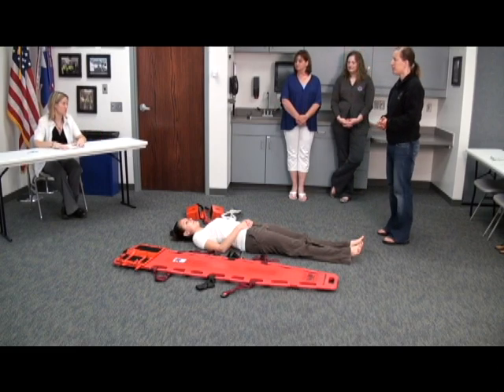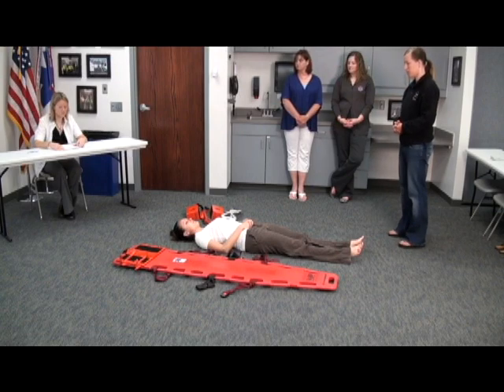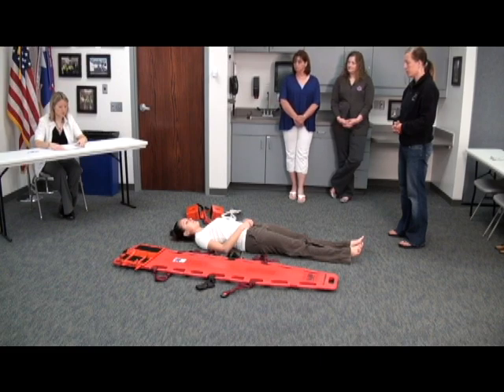You can examine your equipment as I read you the instructions for this station. This skill is designed to evaluate your ability to provide spinal immobilization to a supine patient using a long spine immobilization device. You arrive on scene with an EMT assistant. The assistant EMT has completed the scene survey as well as a primary assessment and no critical condition requiring any intervention was found. For the purposes of this evaluation, the simulated patient's vital signs remain stable. You are required to treat the specific, isolated problem of a suspected unstable spine using a long spine immobilization device. When moving the simulated patient to the device, you should use the help of both EMT assistants. One assistant EMT should control the head and cervical spine of the simulated patient, while you and the other assistant move the simulated patient to the immobilization device. You are responsible for the direction and subsequent actions of the EMT assistants. You may use any equipment available in this room. You have 10 minutes to complete this procedure. Do you have any questions?